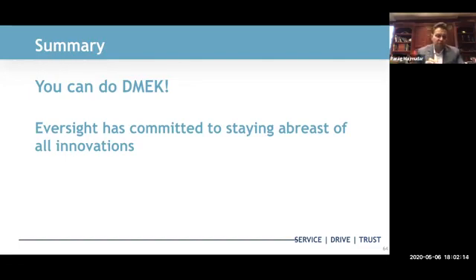But you have to be very careful when you're putting the graft in. If you put the tube in all the way, and as you come out you put a little pressure on the wound, if the graft wants to migrate towards you, you can eliminate that problem 99% of the time. If it does come out, you have not lost anything. Maybe you've lost a couple of cells, but as long as it's not on the ground and it's still within the sterile field, I have reloaded the DMEK graft, rinsed it in BSS, and then reinserted it, and that's fine.